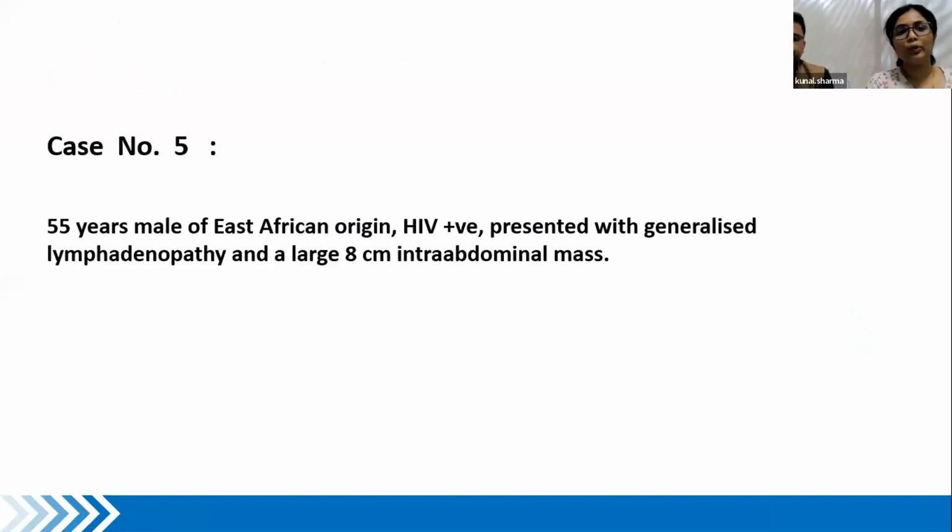This was a 55-year-old male of East African origin. Patient was HIV positive and presented with generalized lymphadenopathy and a large 8 centimeter intra-abdominal mass. We got paraffin blocks for review.